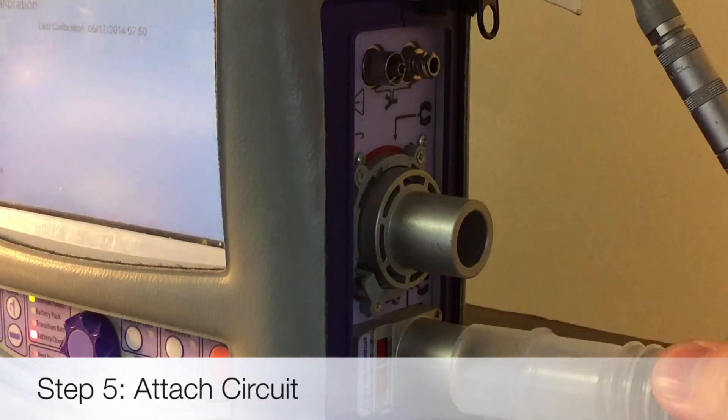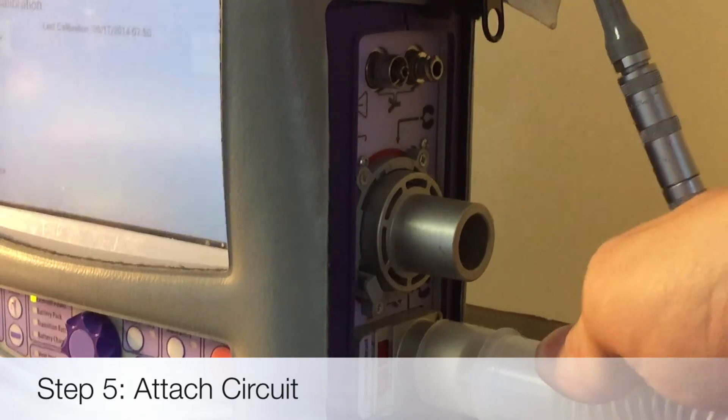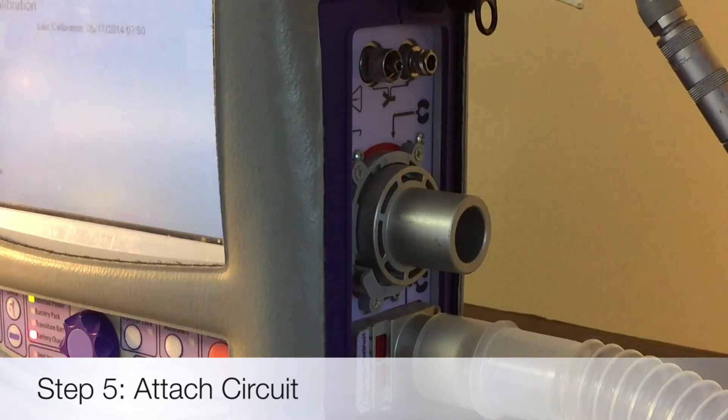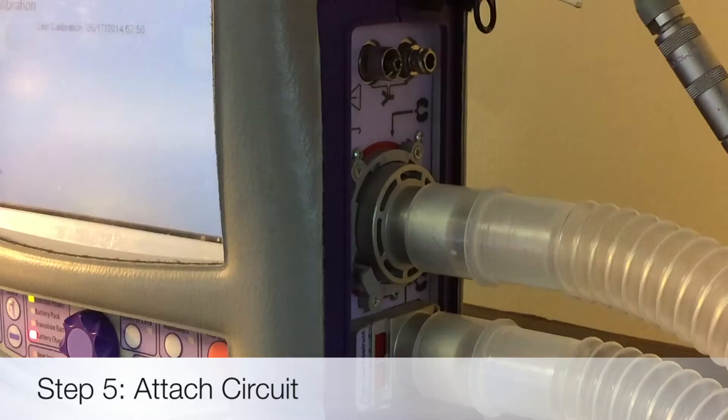Now that it's tightened, you can go ahead and attach it to the vent. This is the inhalation limb and then the exhalation limb is going to go on right now and that's the one with the water trap on it.